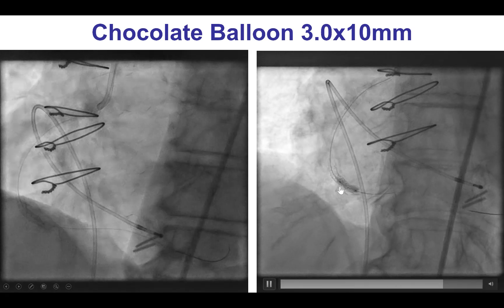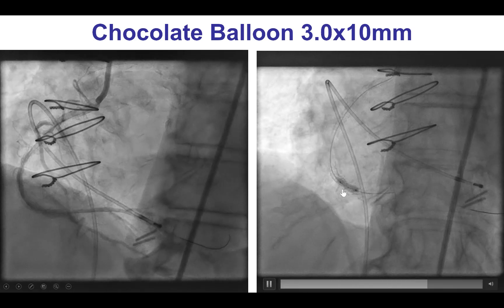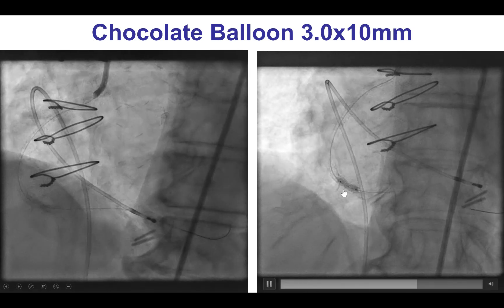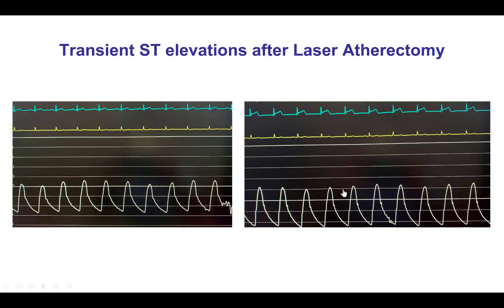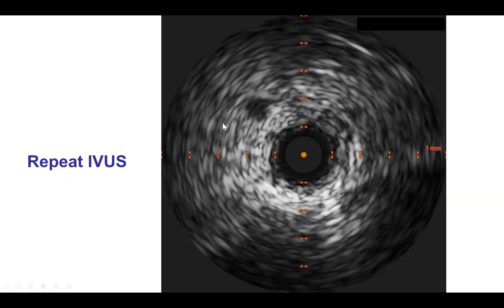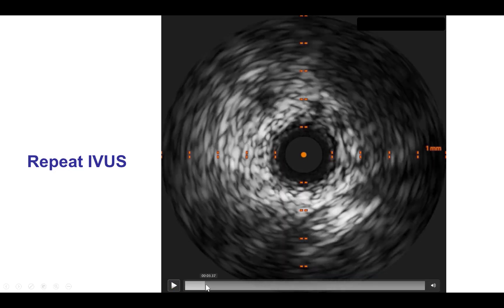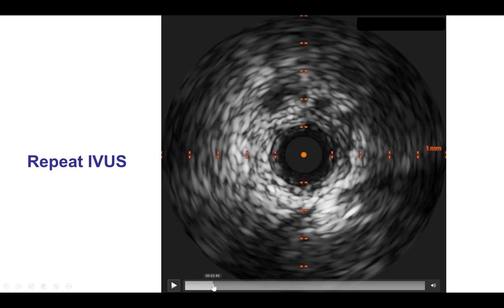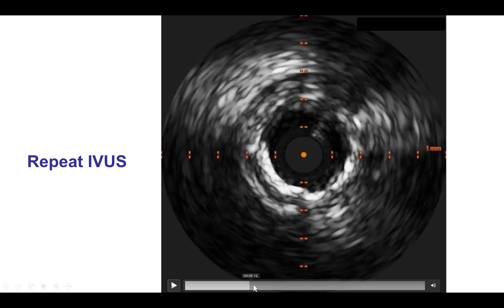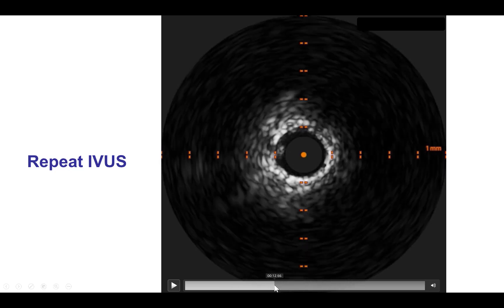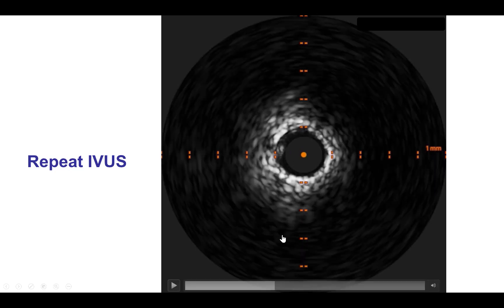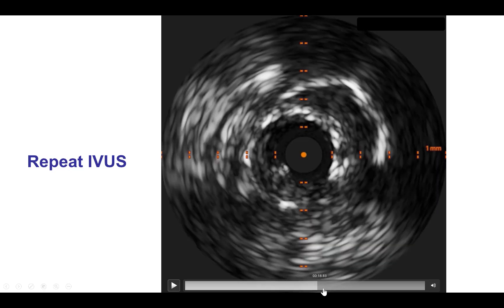We used another plaque modification balloon — a chocolate balloon. Once again, there is a waist in the balloon. The patient also did not tolerate the laser well; there was transient ST segment elevation when the laser was activated. Intravascular ultrasound was once again very useful, showing the bifurcation distally and the area of under expansion, which remained essentially unchanged.